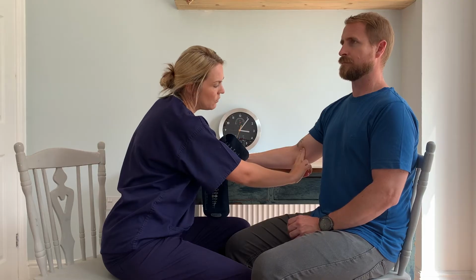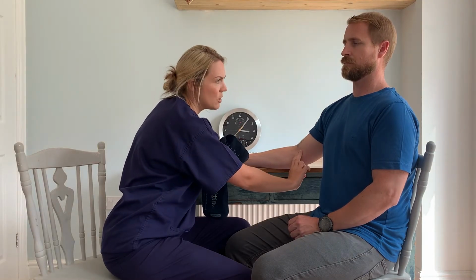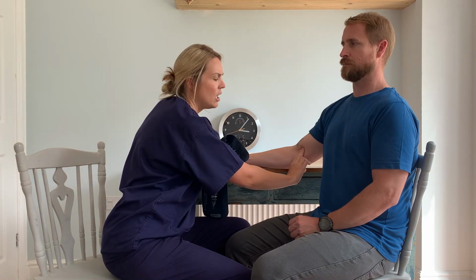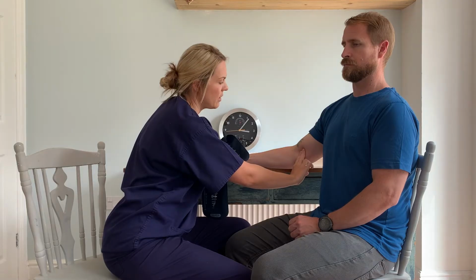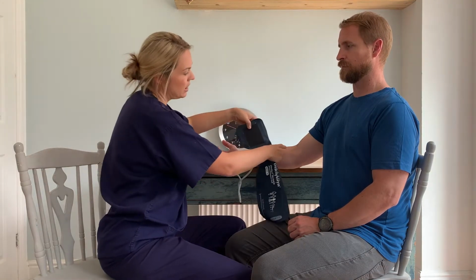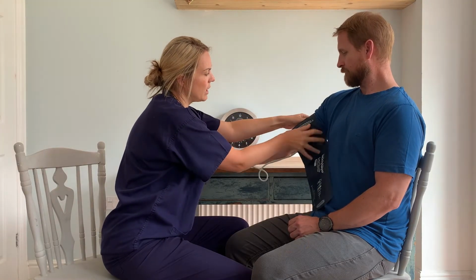So again, using your 2 fingers like we did for the radial pulse, and just feeling around this area, just pressing lightly to begin with, and then a bit more firmly if you need to. And I can feel the brachial pulse right there. So that's where I'm going to place the artery marker. So again, it's about 2 centimetres up from the antecubital fossa, over the brachial artery.